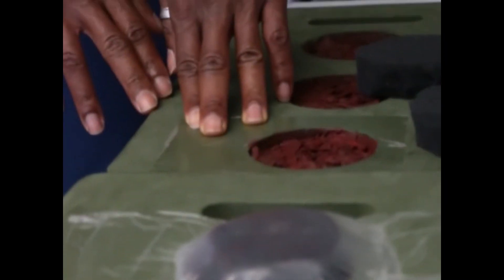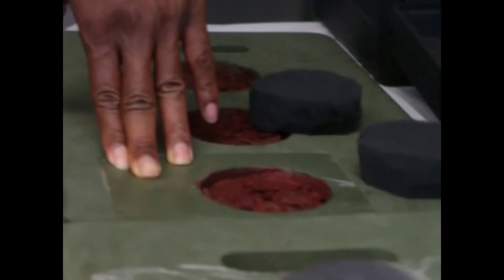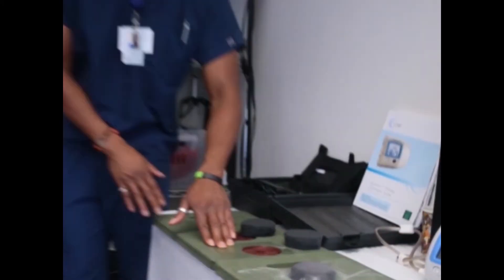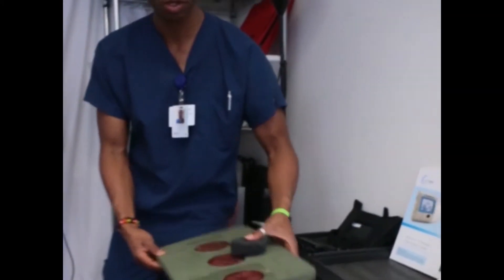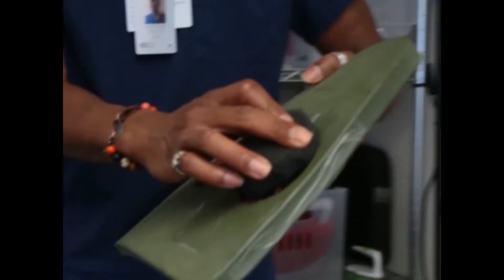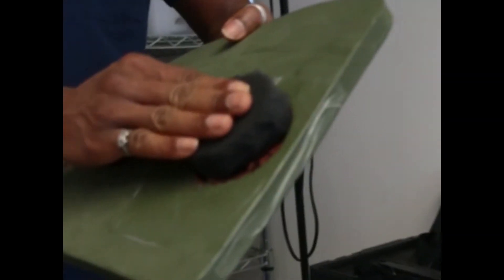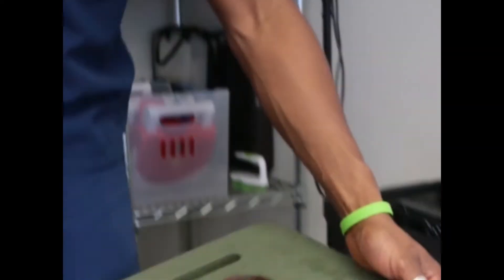You would lay down a piece of drape. You won't see this in a lot of the example videos that KCI has, but this is a technique that I've seen pretty common. Deb, I don't know if you use it yourself or you, Michelle, but you lay down like a windowpane around the peri-wound skin to protect it. Just in case, like you were saying, if you're a little big and it goes over so you're not causing maceration or anything like that. But again, the best practice is to cut so that it's inside the wound margins.